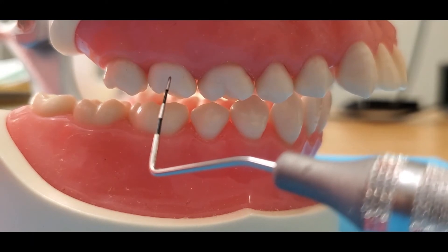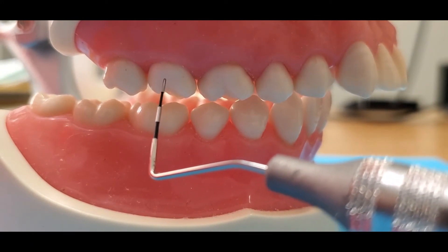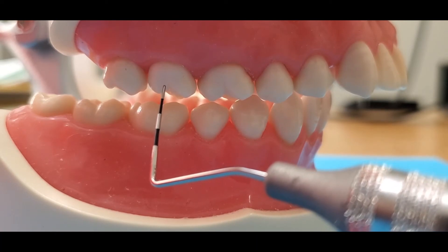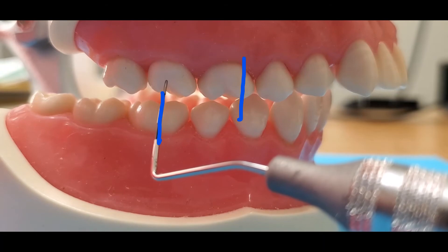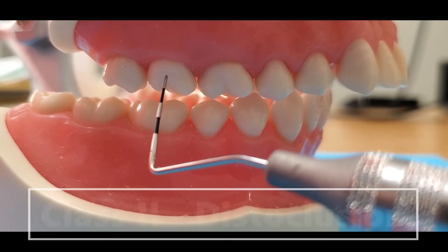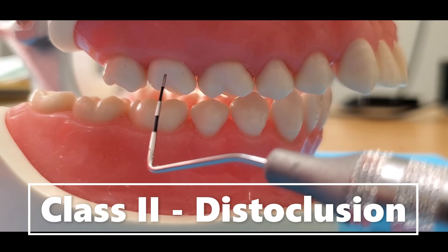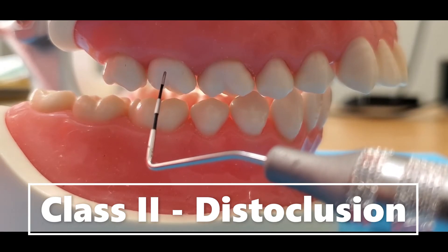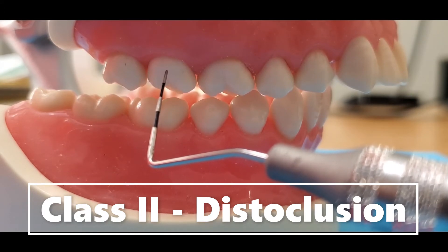I'm going to place my probe in the center and say where am I in relation to the mesial buccal cusp of the maxillary first molar. I am now distal to the mesial buccal cusp of the maxillary first molar. So this is disto-occlusion, class 2 occlusion.